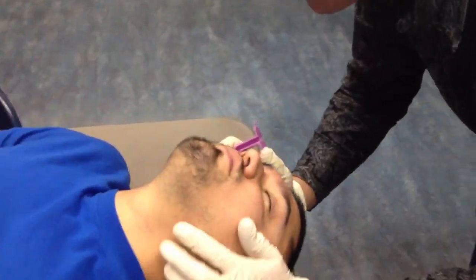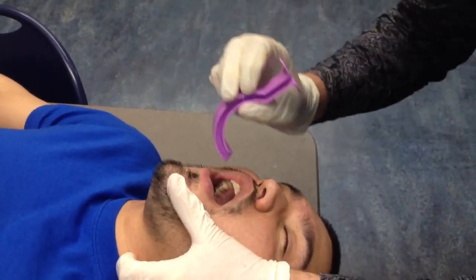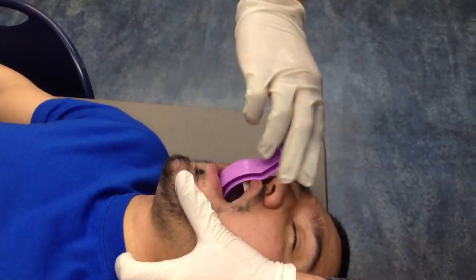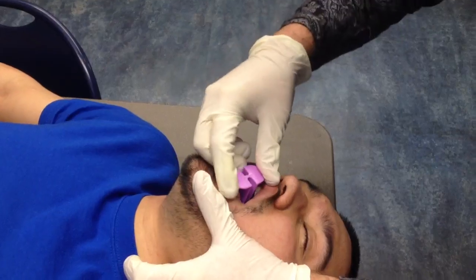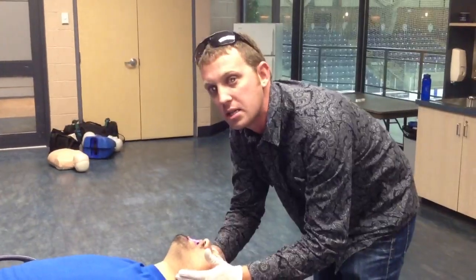Open the airway as wide as you can, open the mouth, and place the tip of the OPA in the back of the throat. Turn it slightly as it slides into place. The OPA is keeping the airway open and depressing the tongue so it does not become an obstruction.